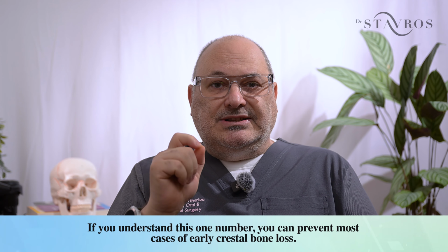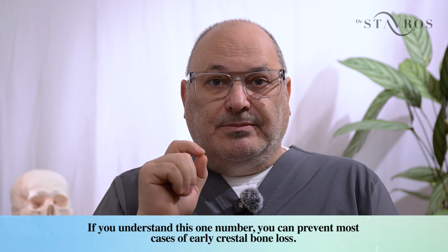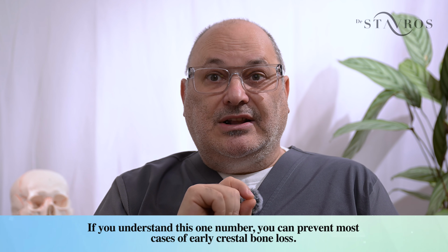The body needs a constant vertical dimension to maintain the soft tissue seal that protects crestal bone. That dimension is about 4 mm from the implant platform to the top of the gingiva. If you understand this one number, you can prevent most cases of early crestal bone loss.